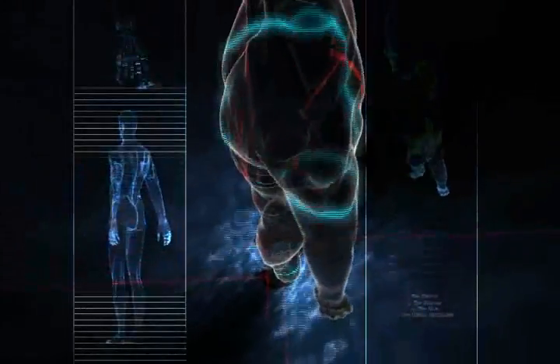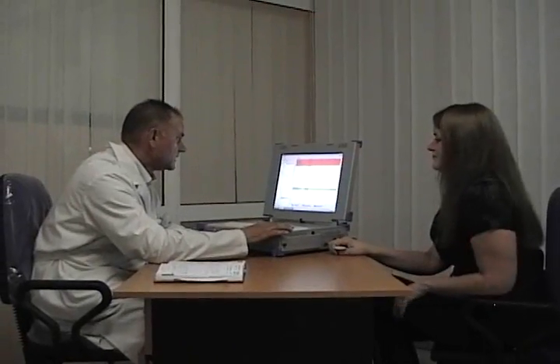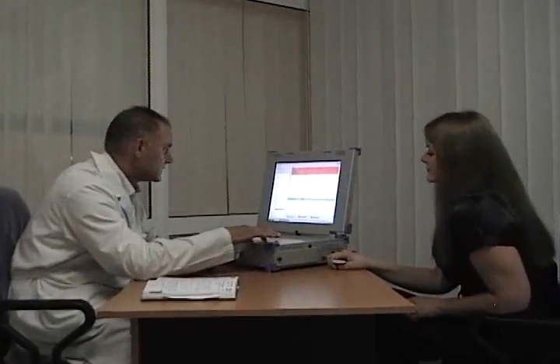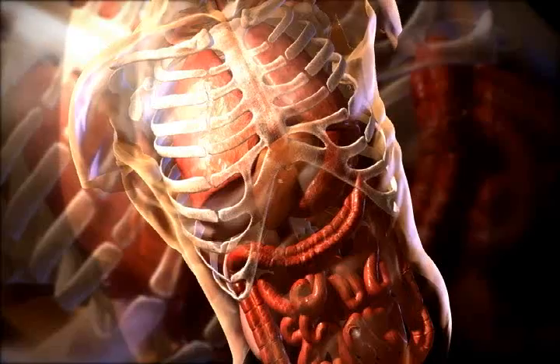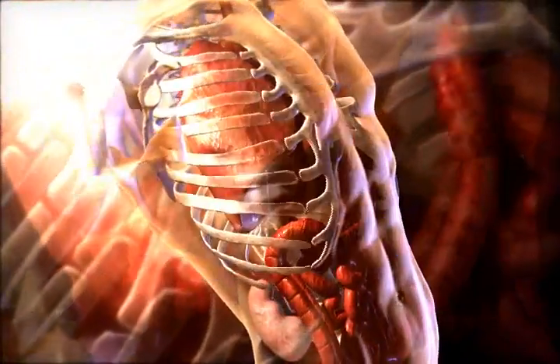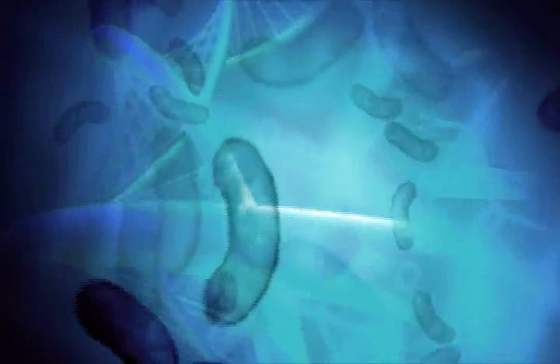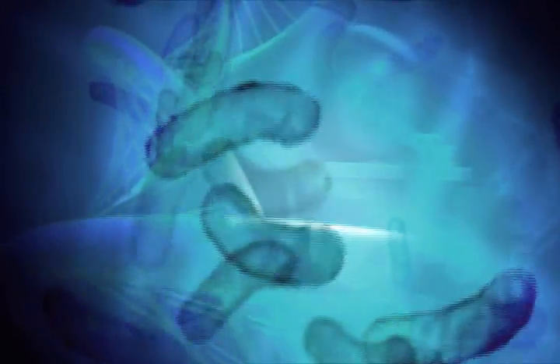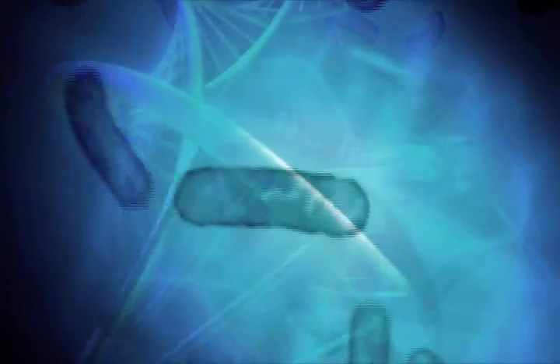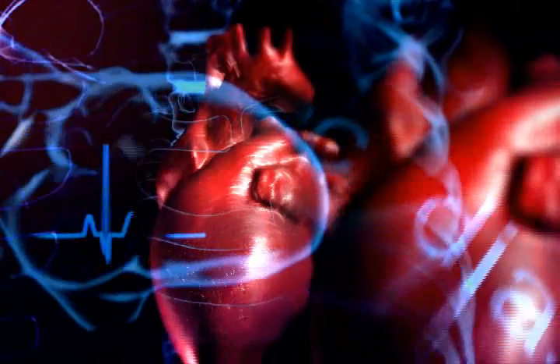CME examination usually reveals a wide spectrum of early pathologies, diseases, and predispositions to them, as well as medical history, reasons, and conditions of acquiring a particular health problem. During an examination, all organ systems are simultaneously tested and compared to the knowledge database of CME, thus revealing abnormalities with pinpoint accuracy. The important feature of CME is the detection of preclinical forms of diseases. It allows physicians to carry out preventive measures.